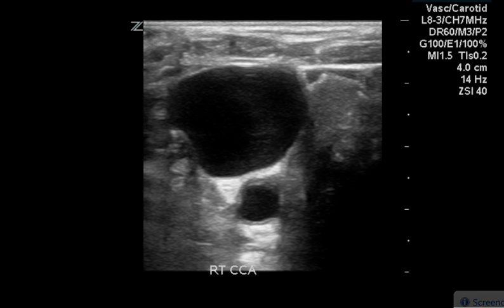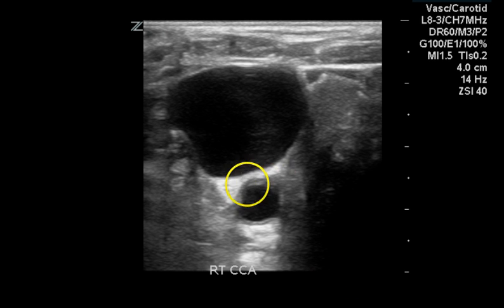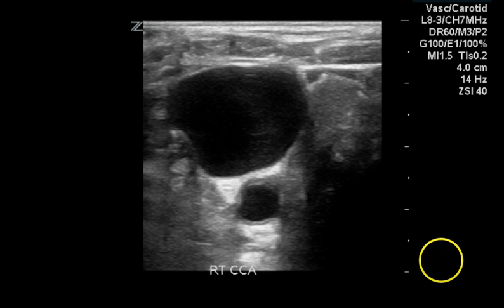This is an ultrasound examination of bilateral carotid arteries. This first image is a transverse image of the common carotid artery and does demonstrate a small amount of intimal thickening.